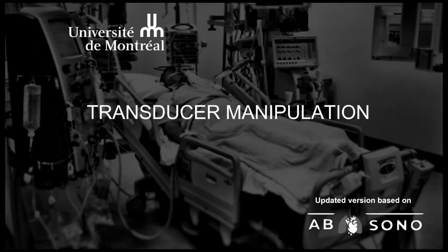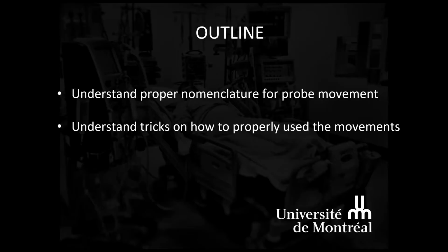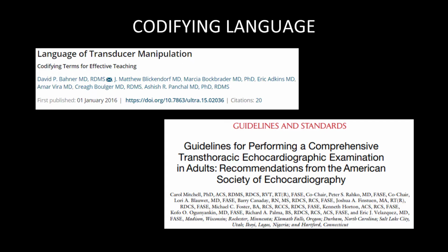This video will be talking about the concepts relating to transducer manipulation. At the end of the video, you will understand proper nomenclature for probe movement and understand tricks on how to properly use those movements.